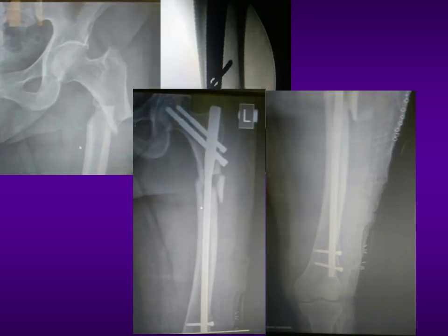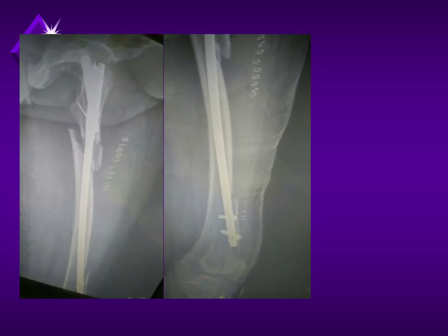Another case, a subtrochanteric fracture treated with a nail, and the surgeon said that he had a lot of problem in inserting the nail, and it was abutting at the anterior cortex distally. This is the immediate post-operative X-ray which he had shared with me, and this is the attempted lateral view. You can see that the nail has been inserted in the reverse fashion.